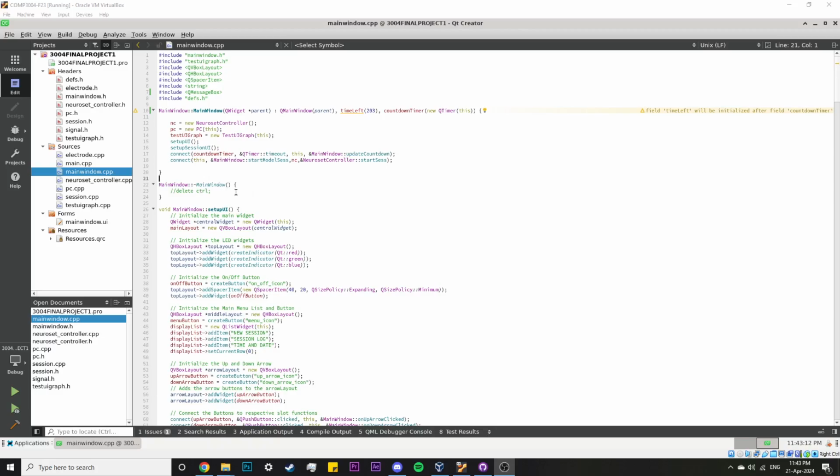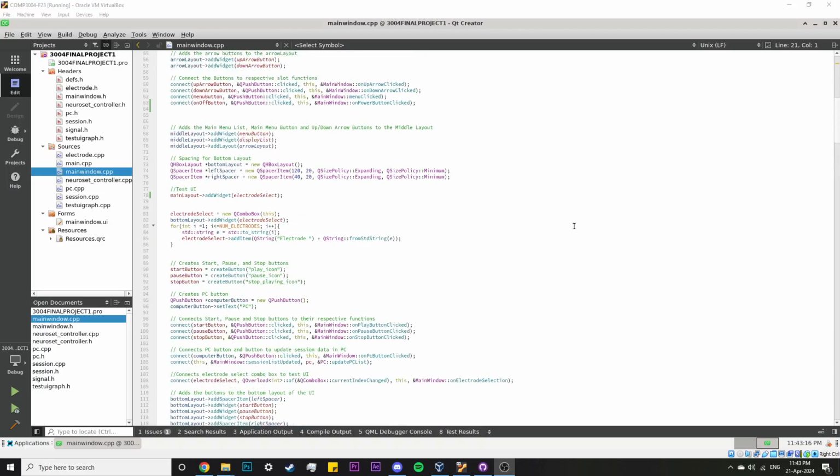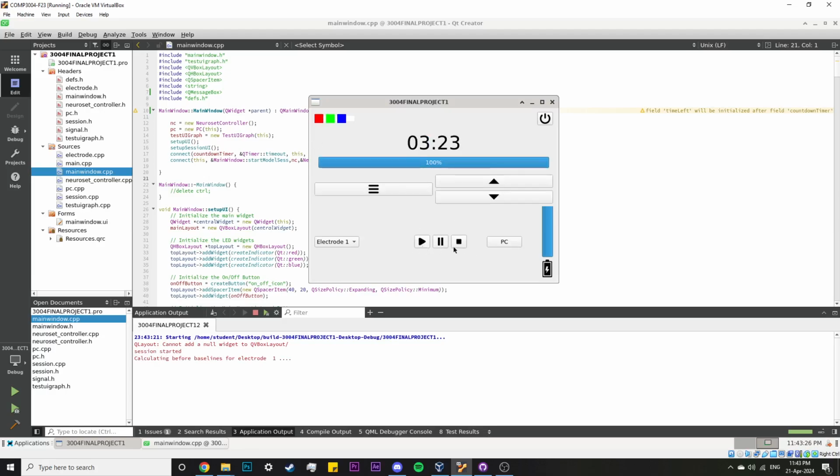We will be demonstrating the code for our final project and explaining each relevant use case. As we explain our code, I'm going to run the application and have it running in the background. If we hit new session, the countdown timer starts and we see that the session started and we're calculating baseline frequencies for each electrode.